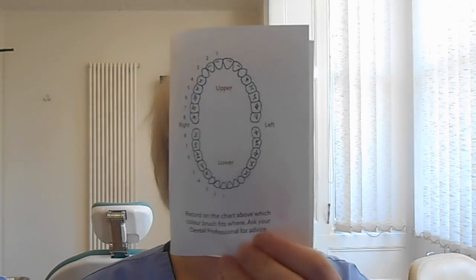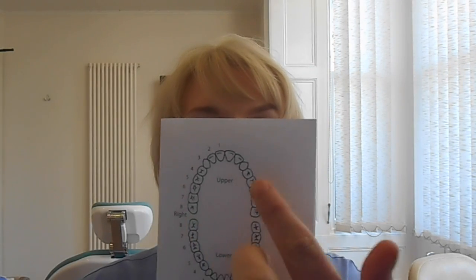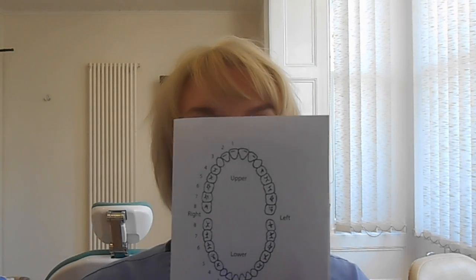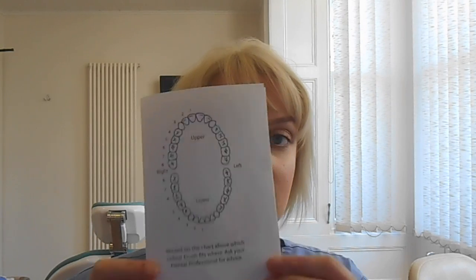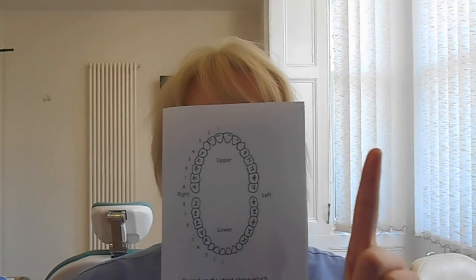So if you are having trouble finding what size you need to use and you don't really know what size fits where, or you don't know how to fit them, the best thing for you to do is to go to your hygienist and ask them to do a mouth map for you, which is one of these, and she will individually go between each tooth. Sorry, he or she, that's a bit rude, he or she will go in between each tooth and fit the perfect size for you, and you get to take this home with you. So this is the top teeth, this is the bottom teeth, this is your right, and this is your left.